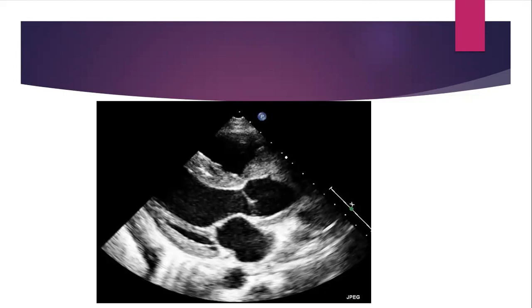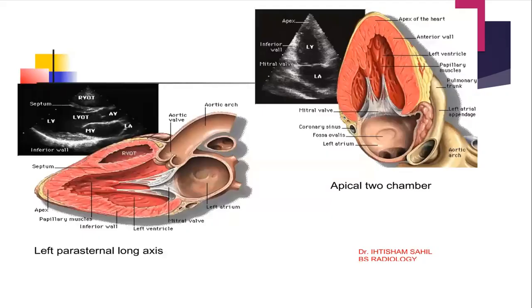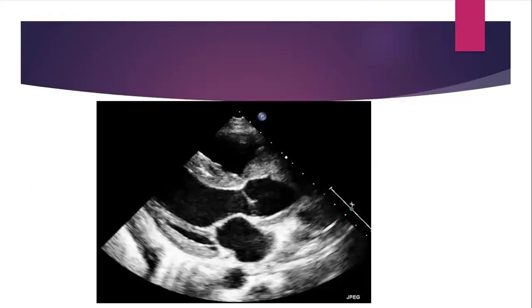Also, you can see the papillary muscles. You can see the mitral valve, and also you can see the left ventricle there. You can even see the papillary muscles there. So this one you have to compare with that one, with this one.